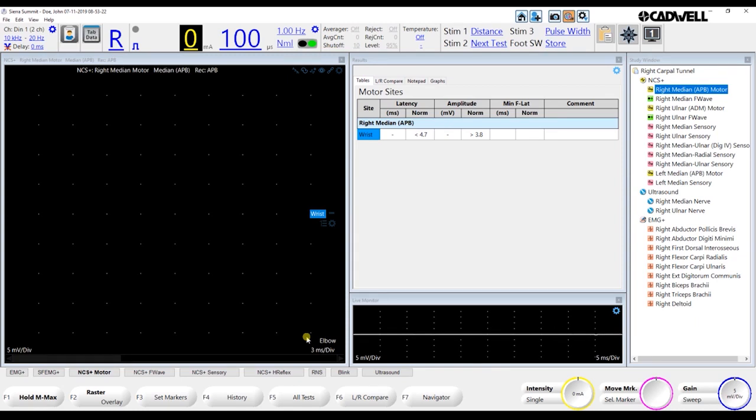When you look at your StimTroller, you'll see different buttons. You'll see ones that are labeled Stimulate and Store. And then you'll see buttons 1, 2, and 3, and then a plus minus button. The plus minus button just reverses the polarity from one side to the other. So the light is the cathode.